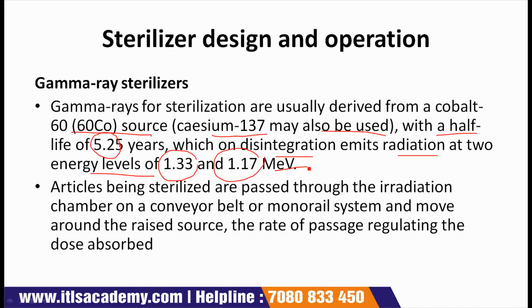For safety reasons, this source is housed within a reinforced concrete building, with walls some 2 meter thick, and it is only raised from a sunken water-filled tank when required for use.